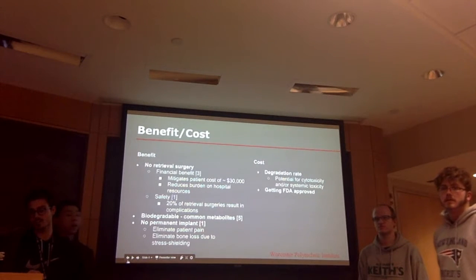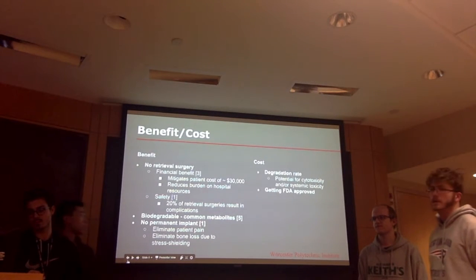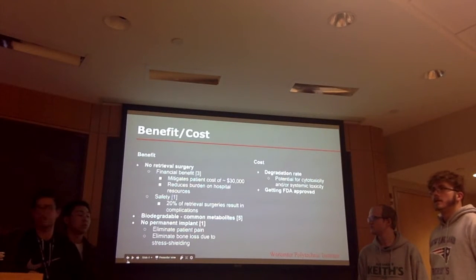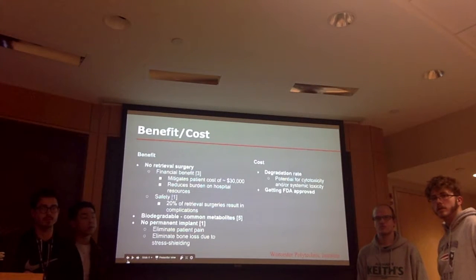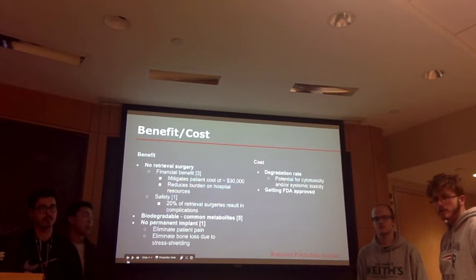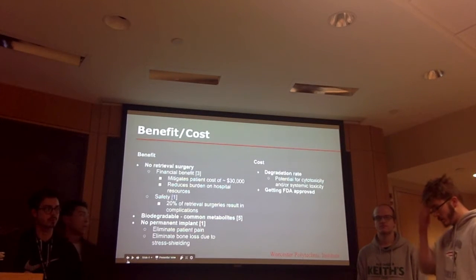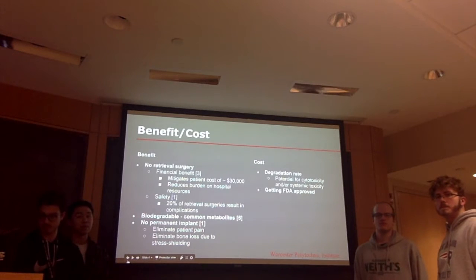And our device is biodegradable into common metabolites, since both magnesium and zinc are found in the body. And lastly, there's no longer a permanent implant, and this will eliminate long-term patient pain as well as eliminate bone loss due to long-term stress shielding effects. And when looking at the cost side, the degradation rate is of great importance as it could be a potential cause of cytotoxicity as well as systemic toxicity. And so by having a low degradation rate, you can have a low concentration of the magnesium and zinc ions in the body. And lastly, the last cost is getting FDA approved.